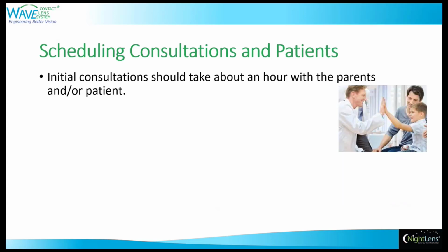All right, scheduling. Scheduling consultations and patients. The initial consultation should take about an hour with the parents and or the patient. Now, this time is divided between yourself and your Ortho K coordinator. What you will be doing is describing the Ortho K process, talking about the nomenclature for the lenses and the actual mechanism on how this procedure affects the epithelium.